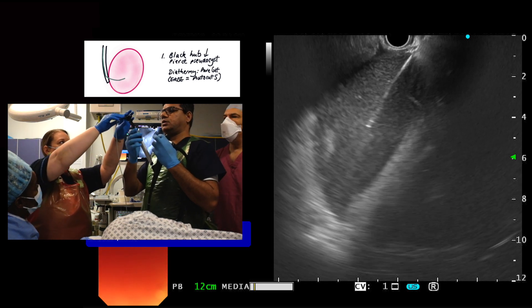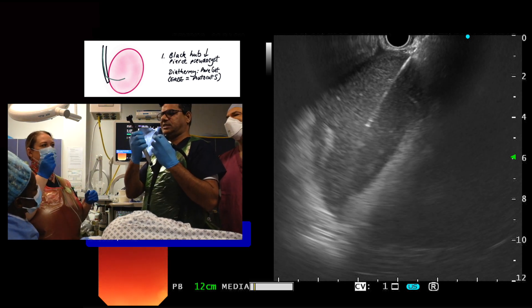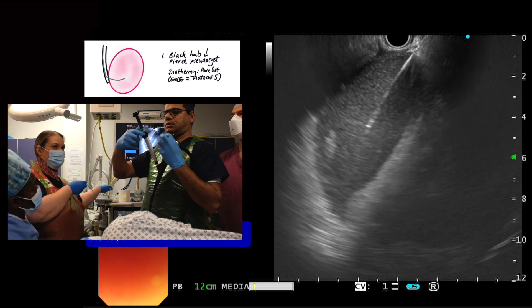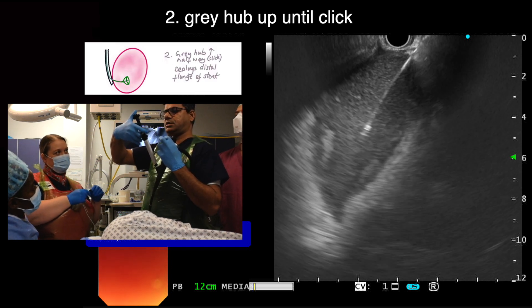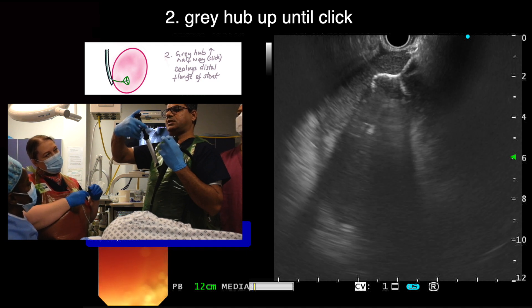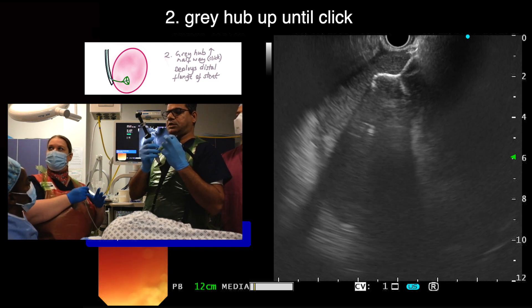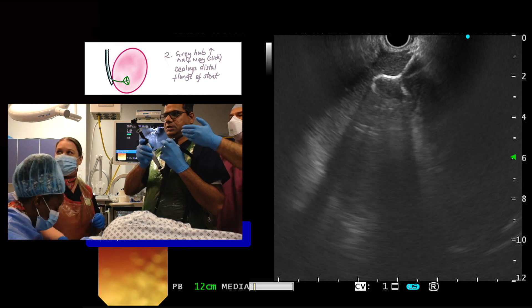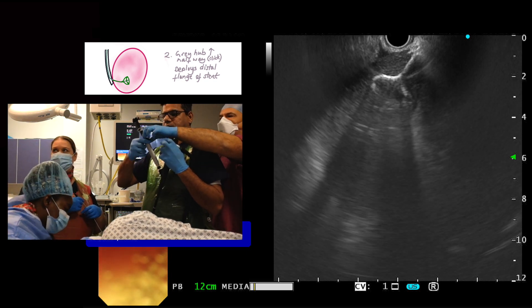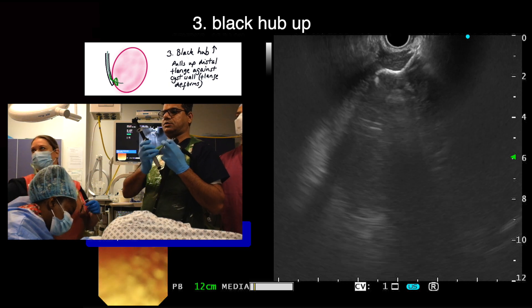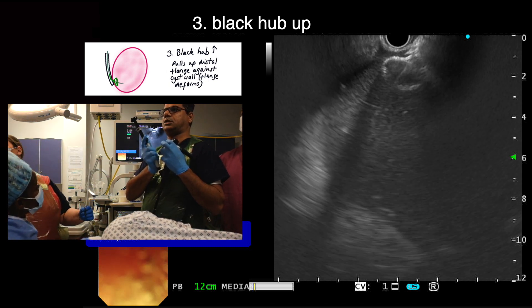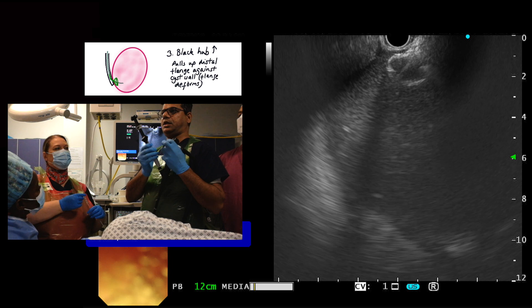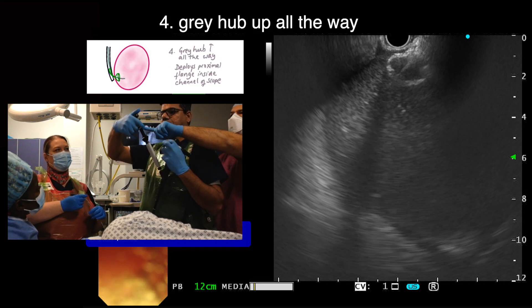The black hub is now locked in position and the diathermy cable is detached from the handle. Next the yellow safety clip is removed and the grey hub is unlocked. The grey hub is then moved upwards halfway up the handle until there is a click. This action deploys the distal flange of the stent, which can be seen on the ultrasound. Next the black hub is unlocked again and gently pulled upwards whilst visualising the distal flange of the stent on ultrasound. The flange moves upwards and opposes against the wall of the cyst. The flange can be seen deforming against the cyst wall assuming an oval shape on ultrasound. At this point we stop moving the black hub and it is locked into position.